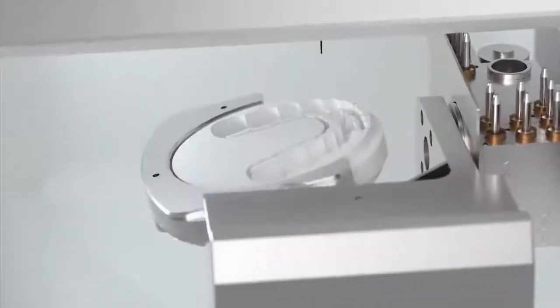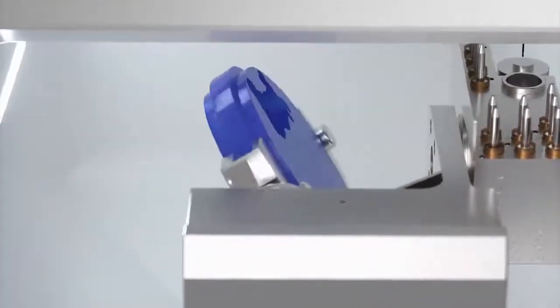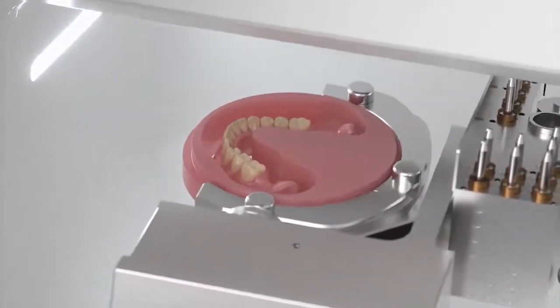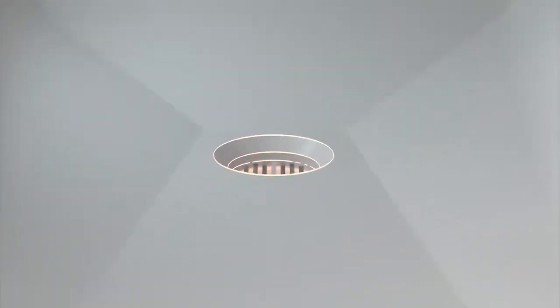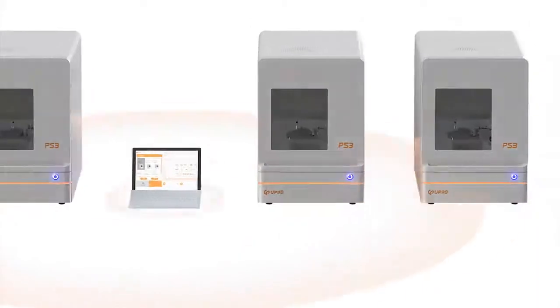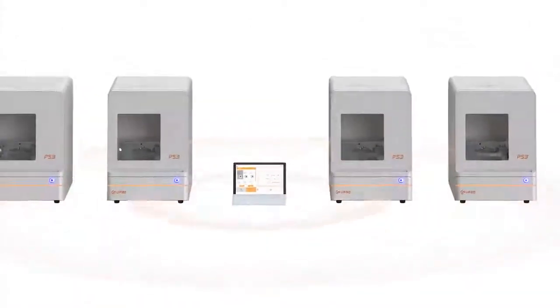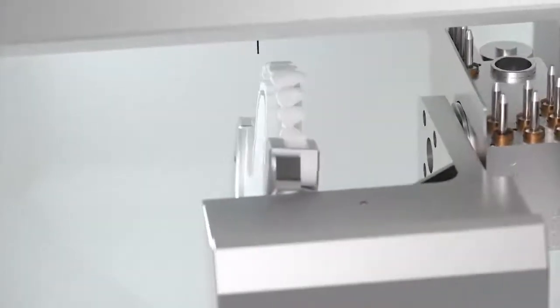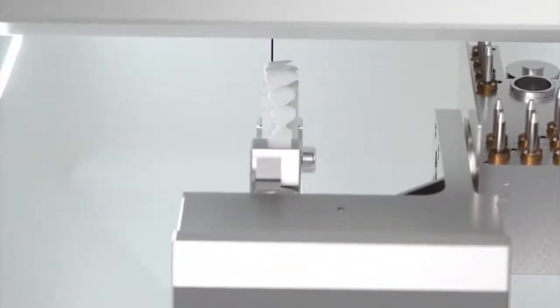P53 can mill zirconia, PMMA, wax, and more. The new location of the dust suction port improves dust collection efficiency. A single platform controls a complete set of devices and monitors the production status of multiple devices in real time. The 90-degree milling method can make the design of the buckle side more beautiful.